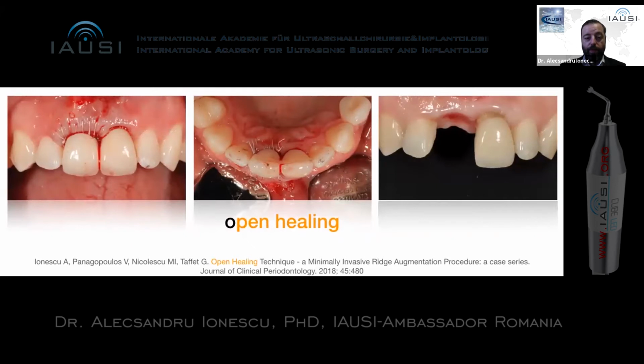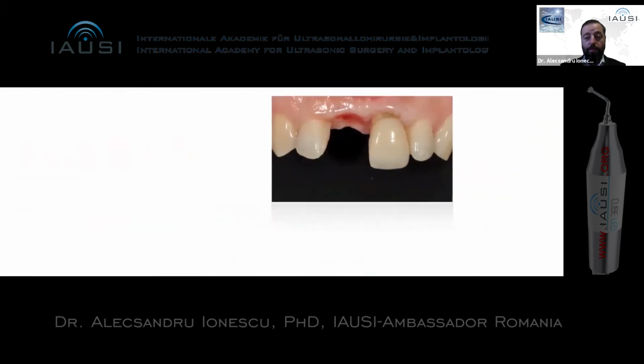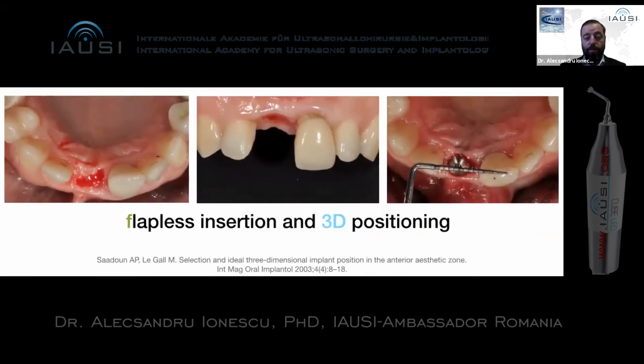This is the provisional. We used the old crown, we cut out the root, and here is how it looks after 6 months. Of course, we had to renew the crown on the other central incisor, so that we will be able to use the 5mm concept from the contact point to the papilla, and also to have a better aesthetic result.